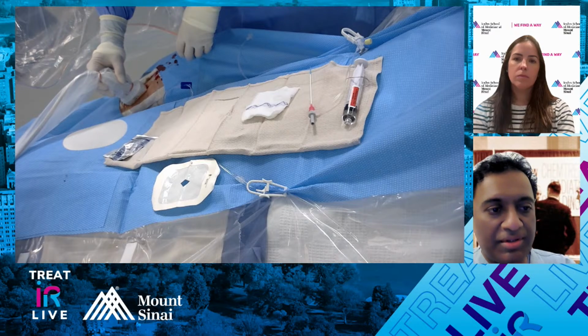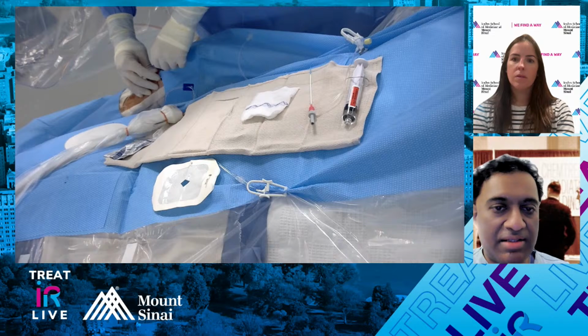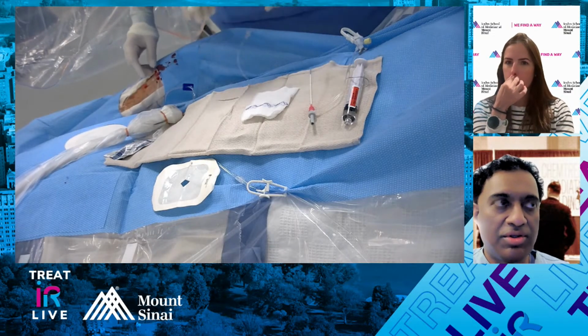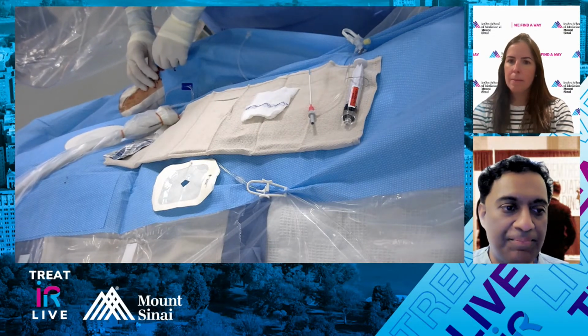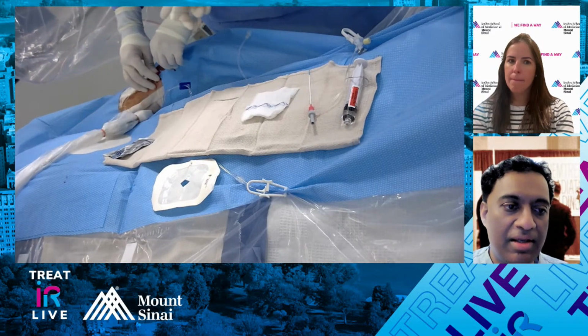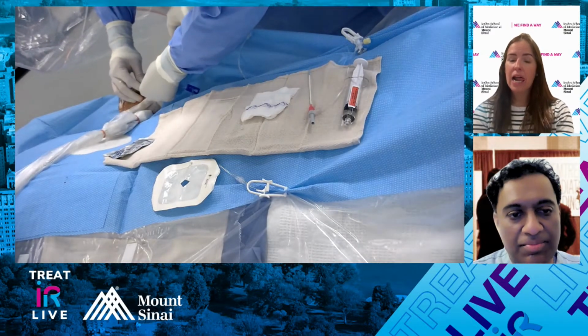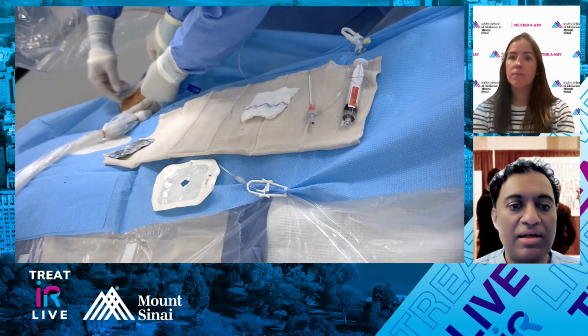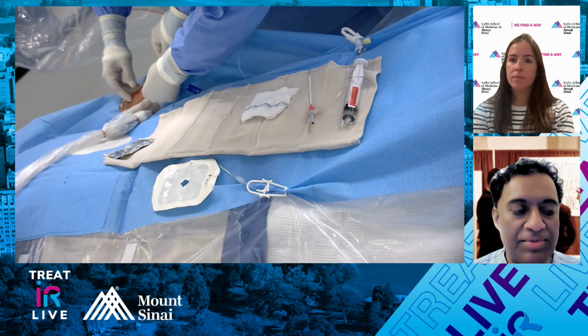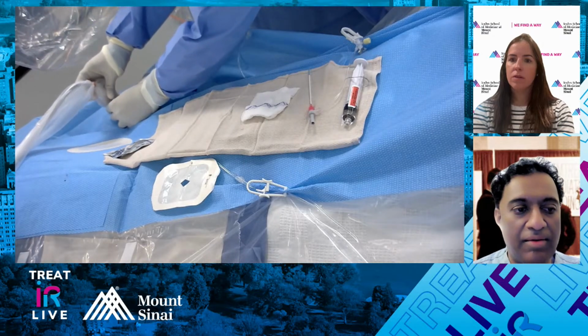I have a low threshold to do this. To take out the hypo and extend makes a lot of sense. The other thing you could do, depending, is sometimes we'll put an IBE, iliac branch excluder, and Cook just came out with one. That enables you to preserve the hypo depending on the ipsilateral limb. So there are ways to do that ipsilateral approach from combo radial brachial.